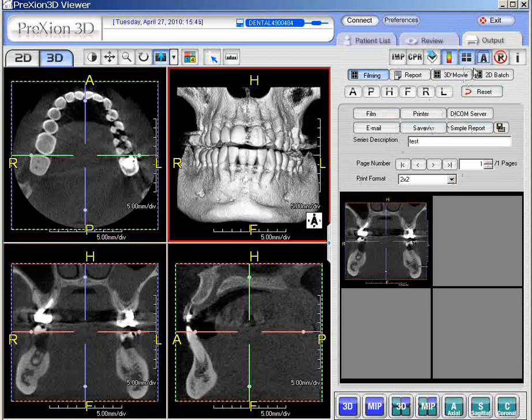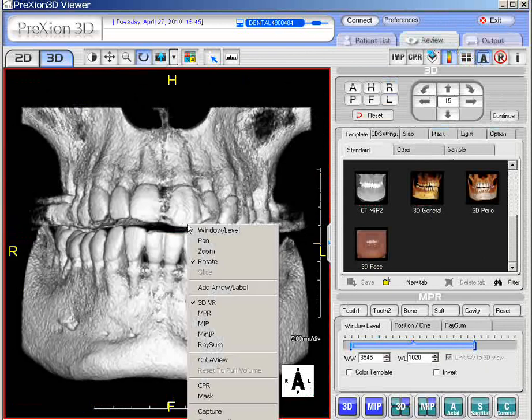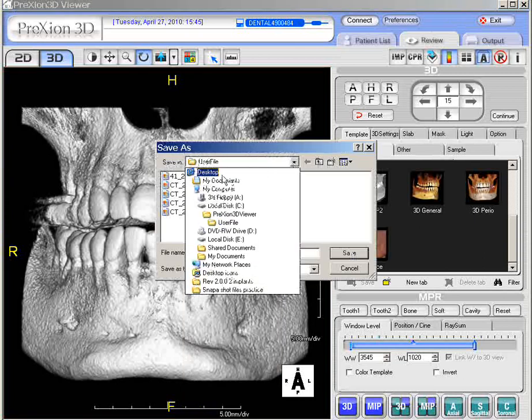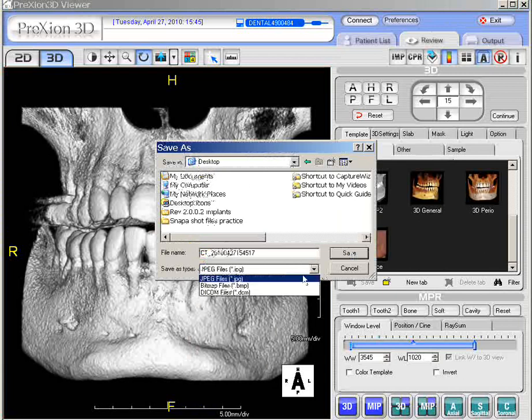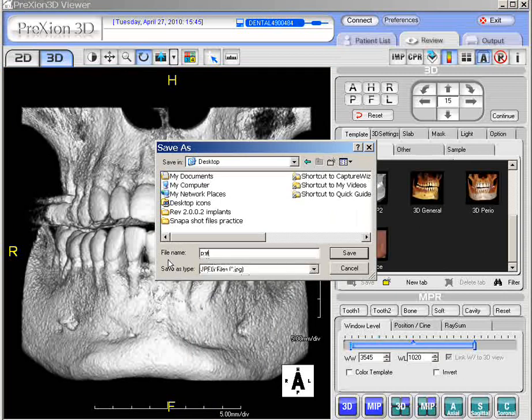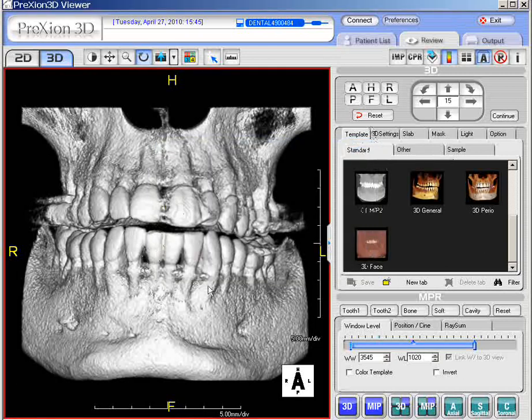Another quick way — if you don't want to go to the Output Panel — let's go to Review and launch a 3D. You can just right-click and go to Save Image. Go down to Save Image and you can save it directly into a particular file, wherever you want, and select JPEG, Bitmap, or .com — usually JPEG is sufficient. Once you hit Save, it goes where you want it. Make sure you have the file name — highlight it, delete it or type right over it, and type your patient name before you capture. That way when you recall it, you know who the patient is and can identify the captured image.